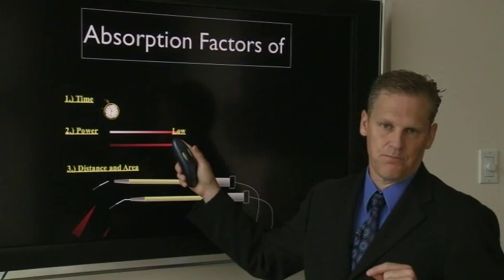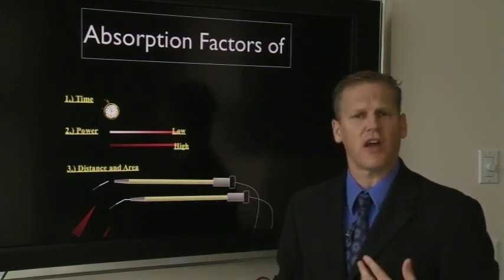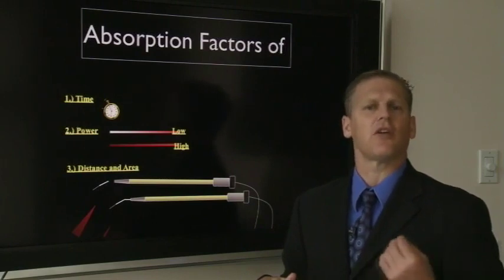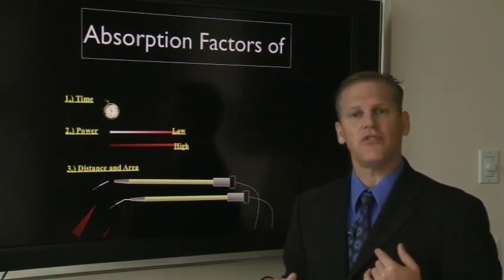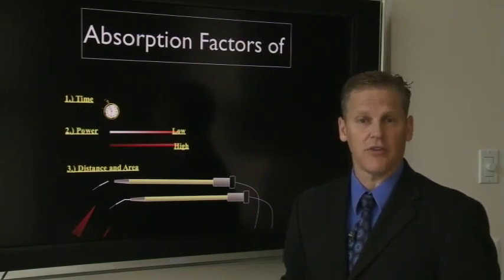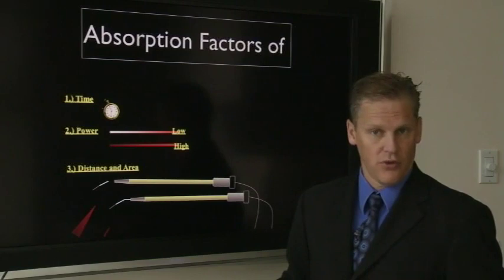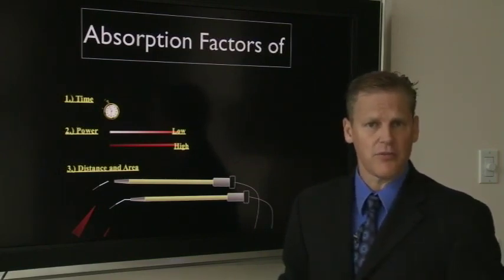As I tell the story, I was lecturing once and a person came to me saying that he was noticing a lot of charring. He was noticing a lot of recession. And when I talked to him about the settings, he was using 2.5 to 3 watts continuous wave with his diode laser to trough. I said, do you notice a lot of darkness? He says, yeah, but if I use anything less, it really takes a long time for me to trough.